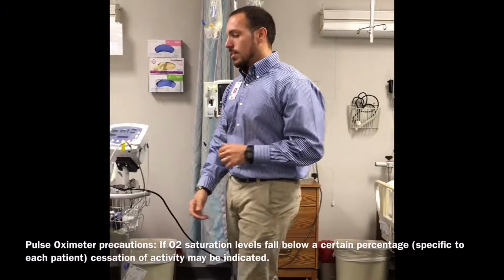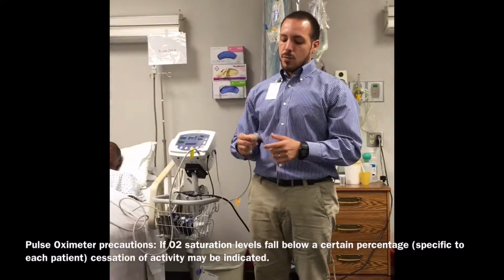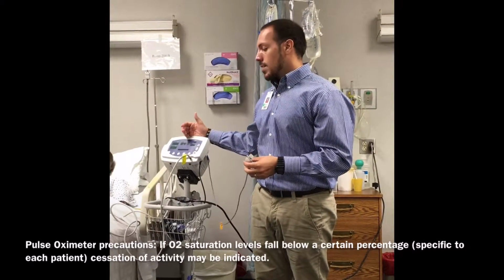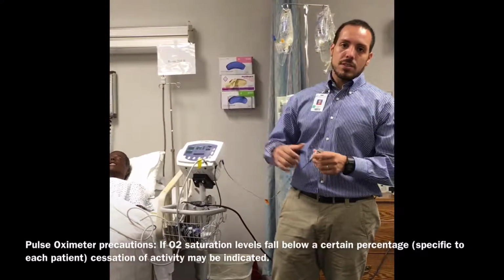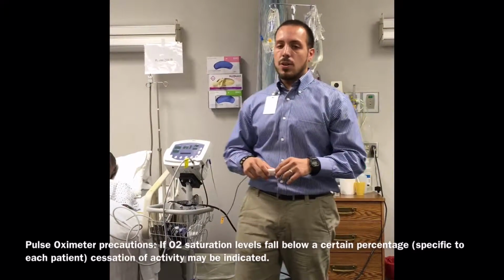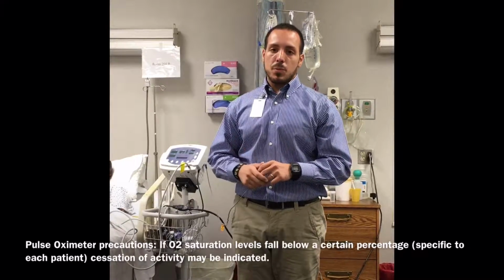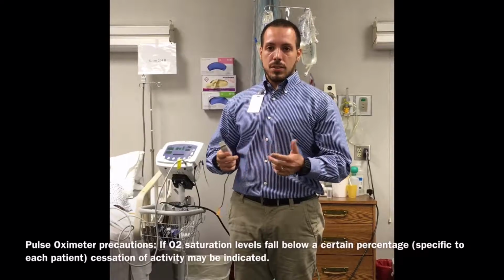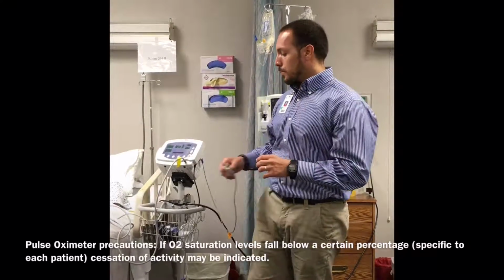Our next device is a pulse oximeter. We've used different ones inside of lab, but this one, as you can see, is right next to the patient, and it's going to be hooked up with the temperature and the blood pressure cuffs. The pulse ox, as we know, is a device that measures the proportion of oxygenated hemoglobin in the blood. This one is going to be used right on the finger, but you can also see them on the ear or even on your toes.